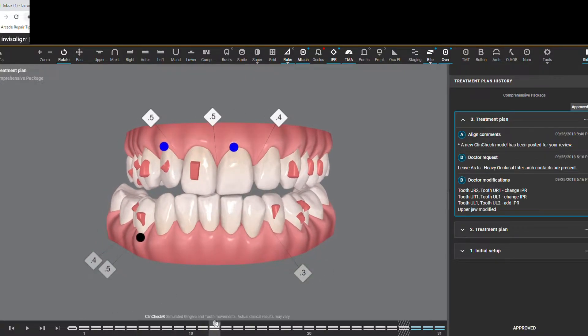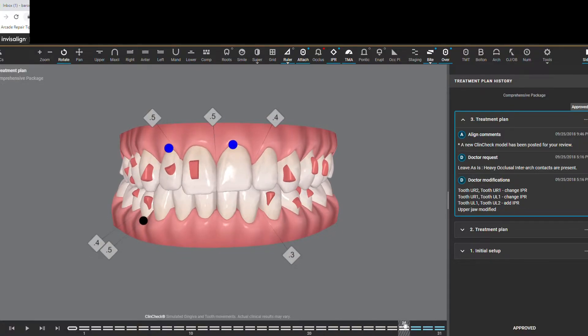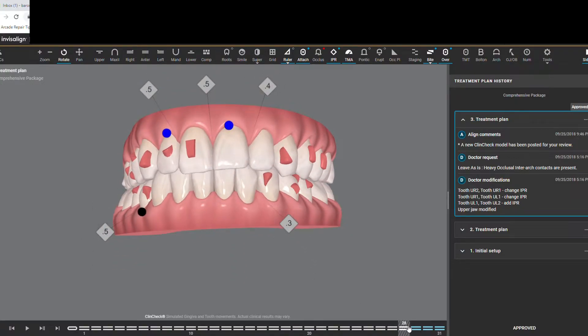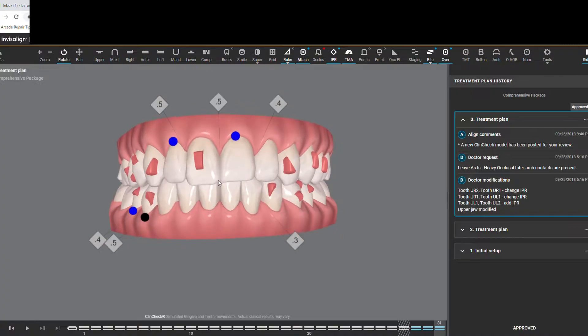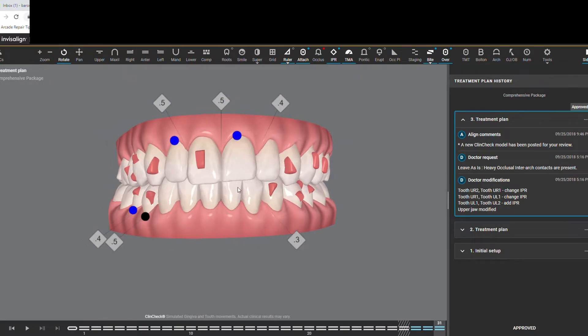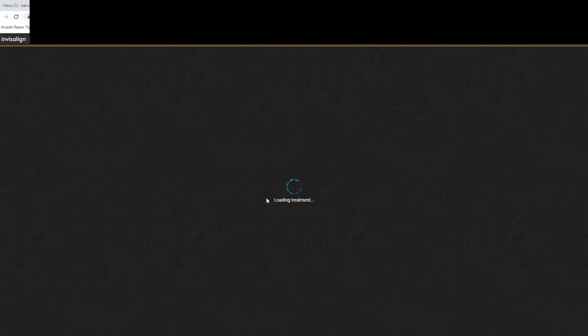Scrolling through towards the end, this person's bite kind of jumps right there. That doesn't actually happen in real life — the software doesn't have a way of slowly transitioning the bite, so whenever it shows on screen it looks like a big jump. One thing to note about aligners is that this computer simulation is not 100%, so we're not going to get people to the final result predicted on the computer simulation every time. So we do what's called a refinement.